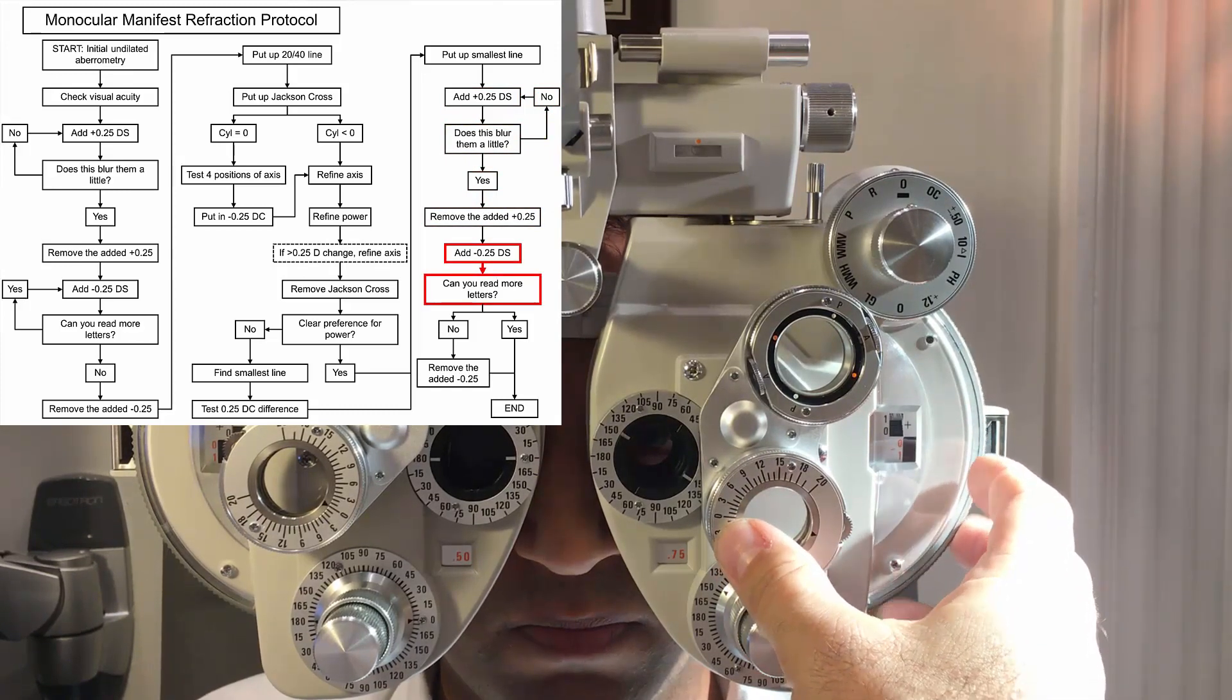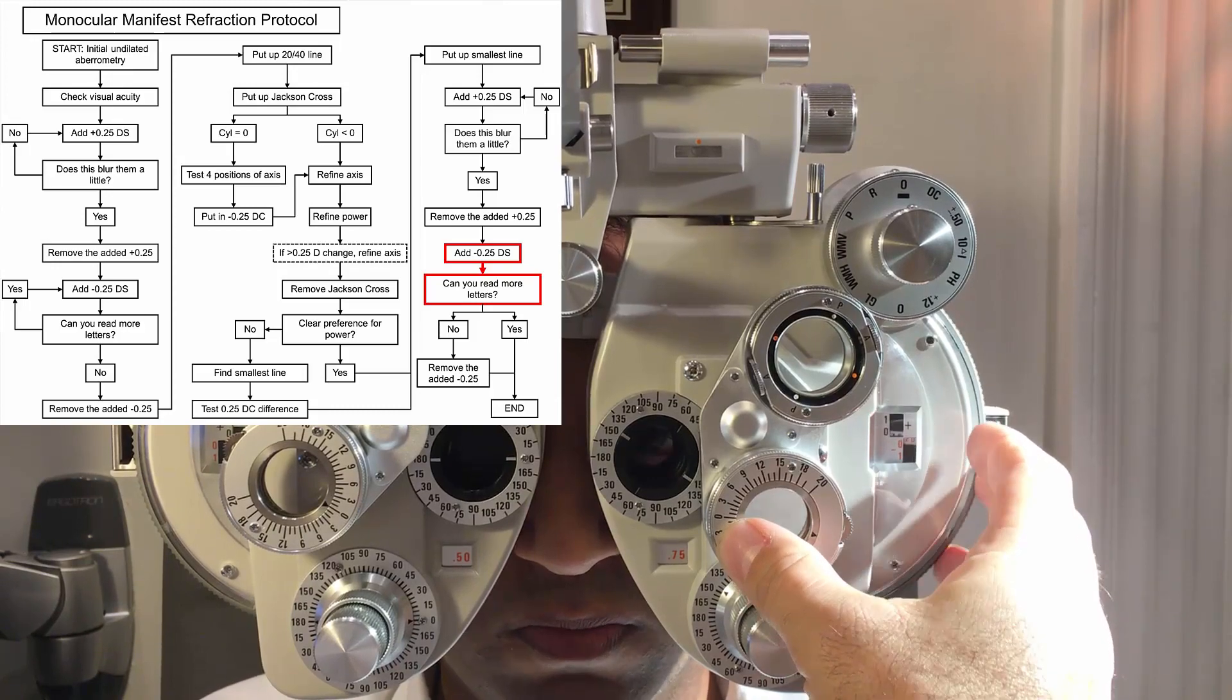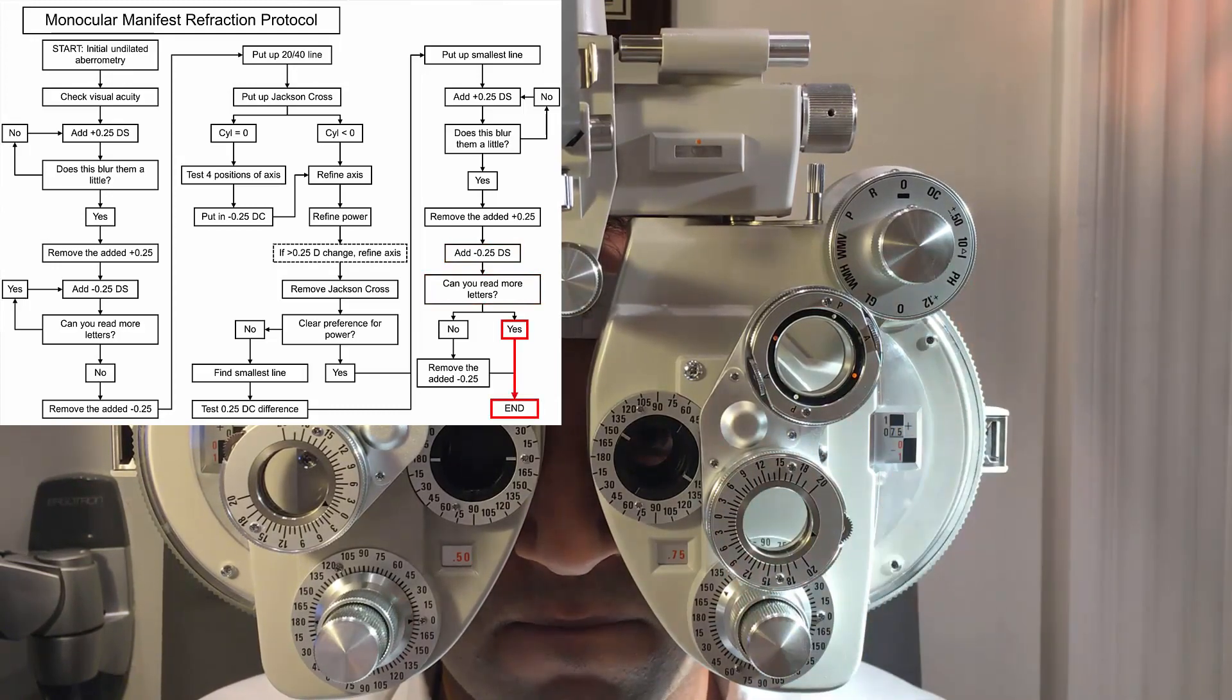And between one and two? Two. Two's a little bit better. Okay, good.